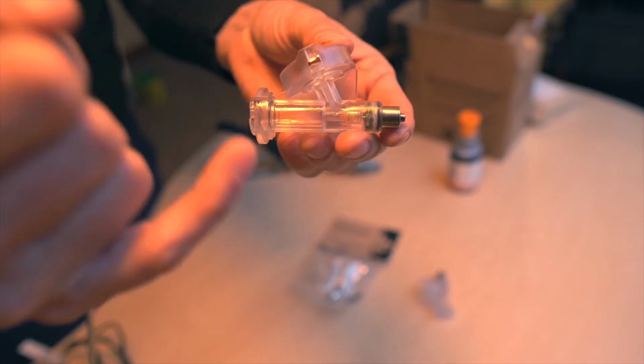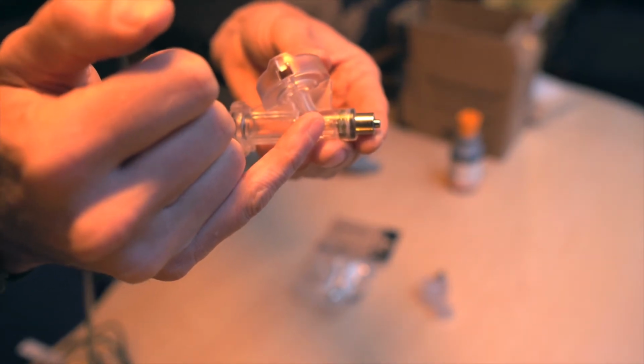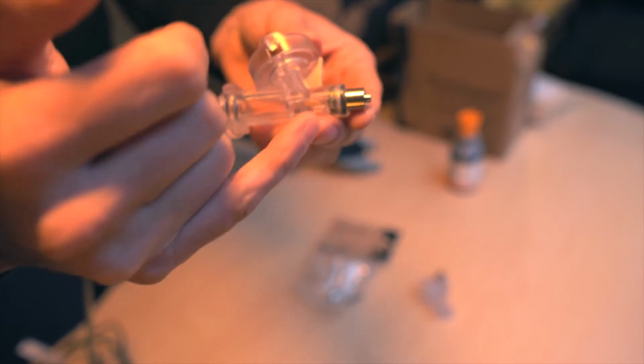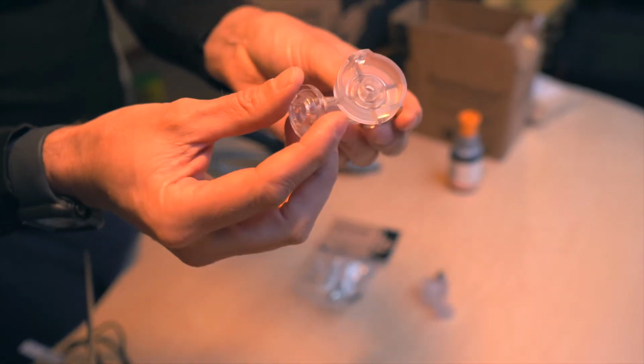Over time, the local anaesthetic will start to corrode the little spring that's in the front of here, and it'll start to rust, and so will this metal part at the front. So it's certainly been seen as an annual replacement.